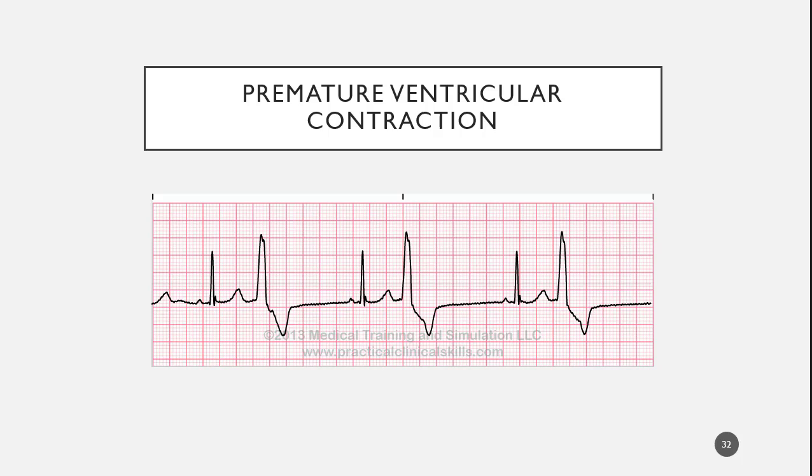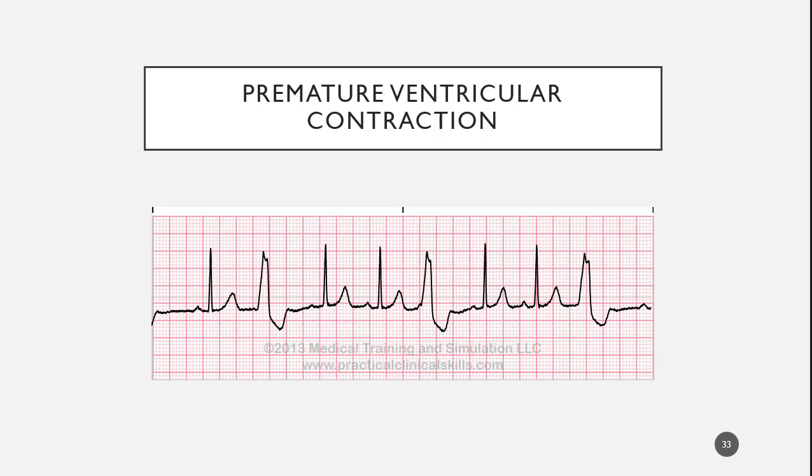Everybody clear on why this is ventricular bigeminy? Okay. So, ladies and gentlemen, boys and girls, what's that called? Let's identify it. What's the rate? Trigeminy. What's the rate? 80. Okay. Rhythm. Regular. Okay, good, good. You see P waves?